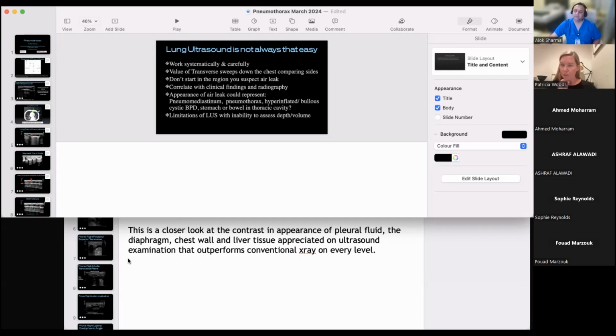So not suffering any. So you're talking about a stable baby that you've observed this sort of A-prime profile everywhere? Yeah, the A-prime profile for most of the area, because this is a small rim of pneumothorax around the lung. It could be. I've seen babies that are incredibly stable where I've gone and not been able to find a lung point, and it might be that the whole of the lung is separated. But like we say, it could be microns thick, and you have to put it back into clinical context then.